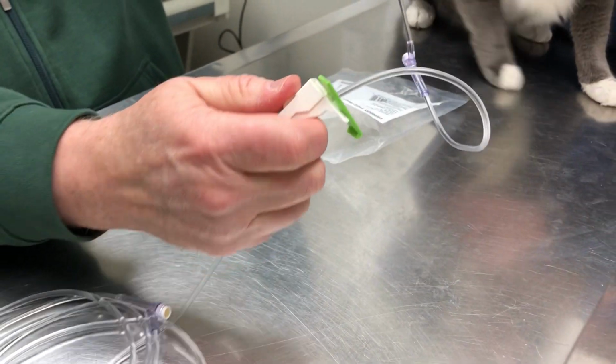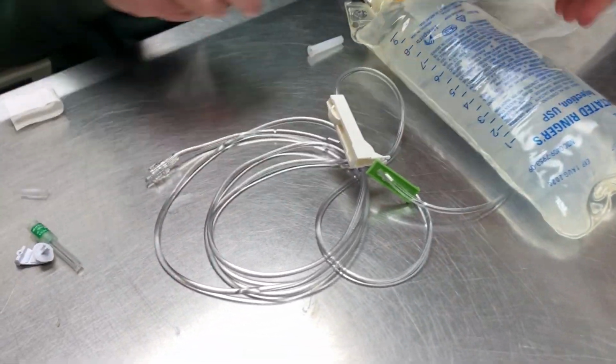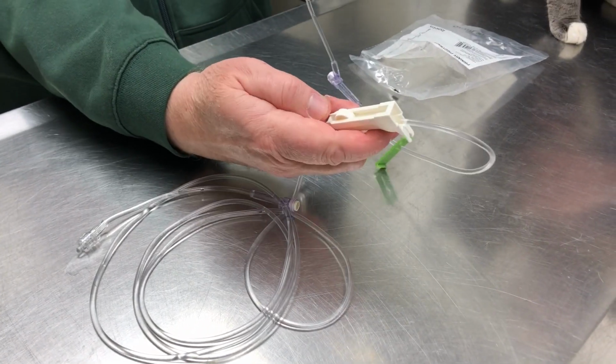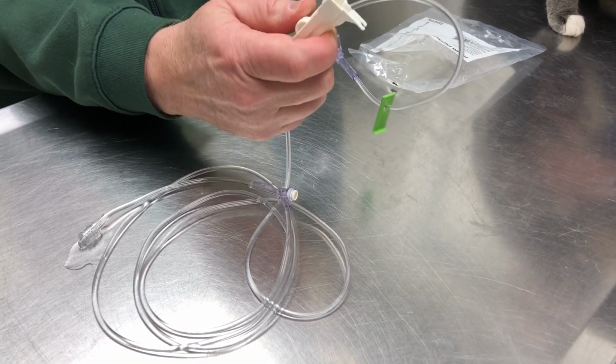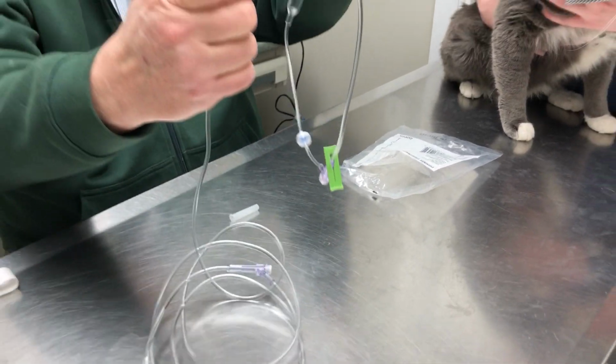So right now it's running through, and it already ran through. I'm going to just take this end off so you can see it come out. So when we have fluids, when we turn it on, we roll this little roller up, and it will start to drip out. And you can see that it's coming out now. And if we close it off, that'll all stop.